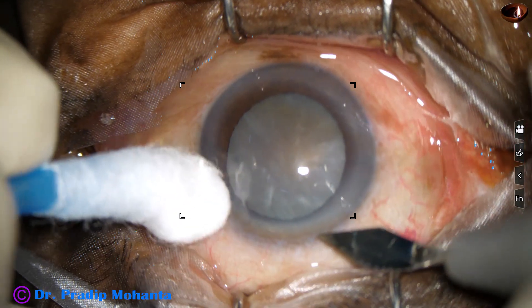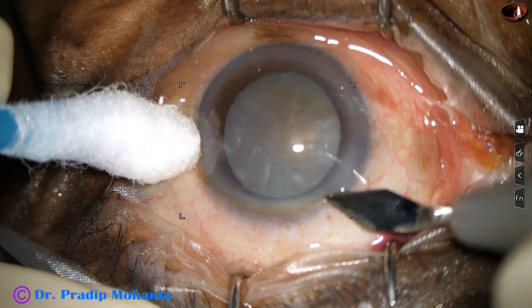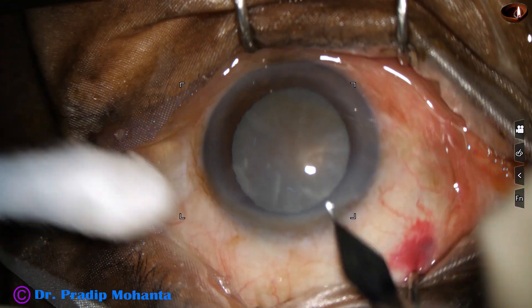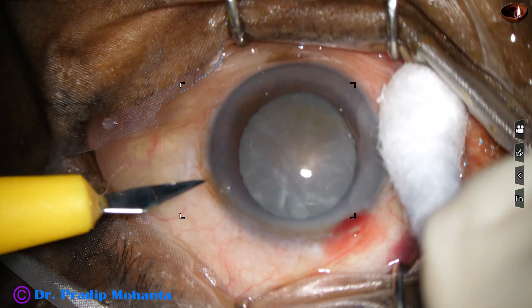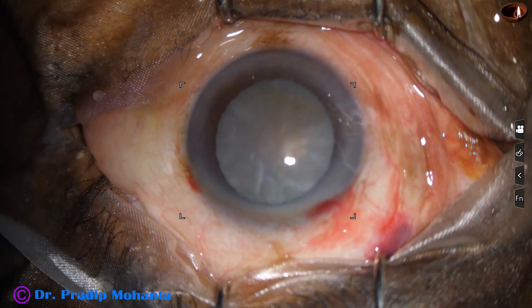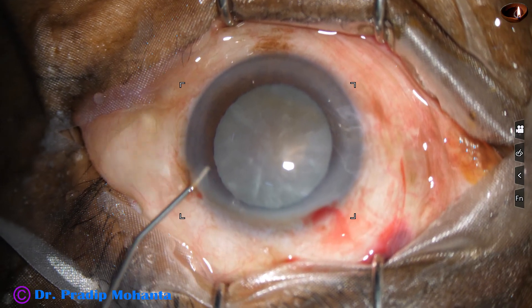This is the main incision with a 2.8 mm steel keratome at mid-limbus. You can see a little blood oozing out. This is good because when we include some capillaries in the incision, healing is faster and better.